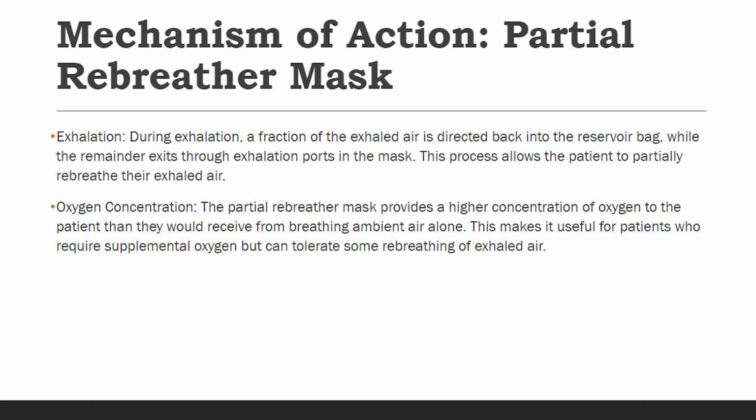During exhalation, a fraction of the exhaled air is directed back into the reservoir bag, while the remainder exits through the exhalation ports in the mask. This design enables the patient to partially rebreathe their exhaled air. Importantly, the partial rebreather mask provides a higher concentration of oxygen to the patient compared to breathing ambient air alone.